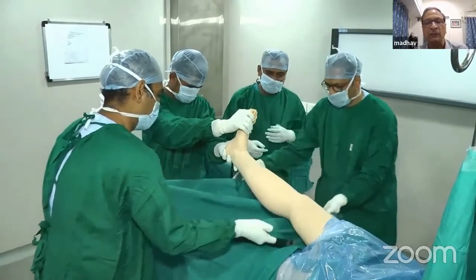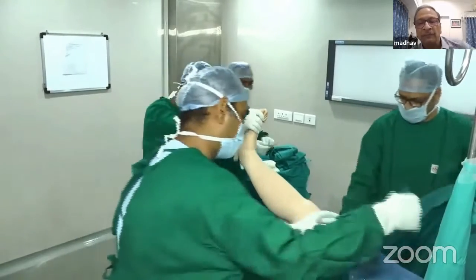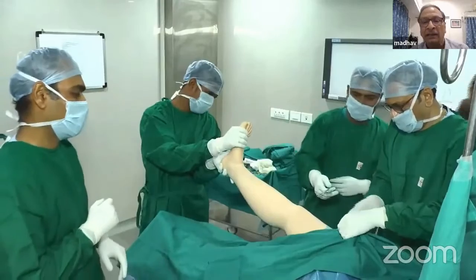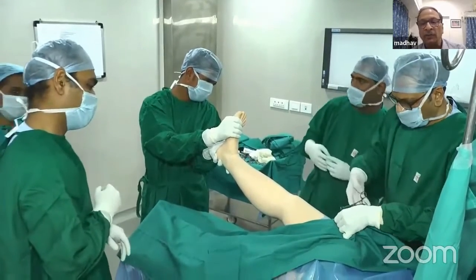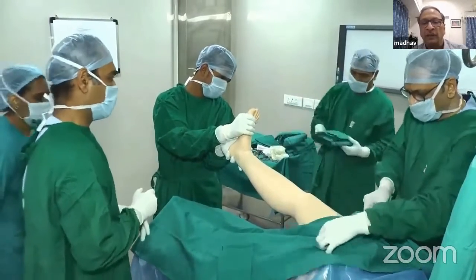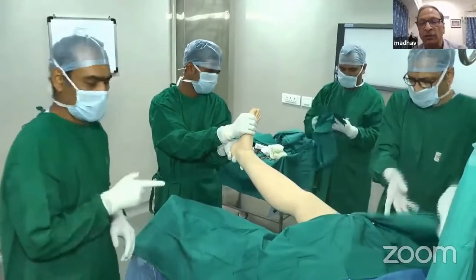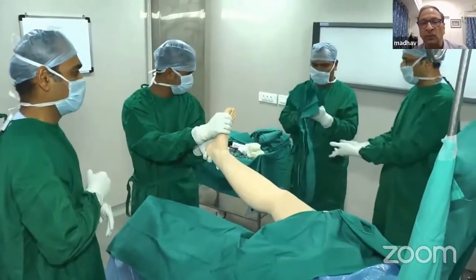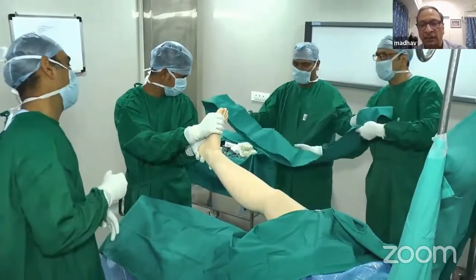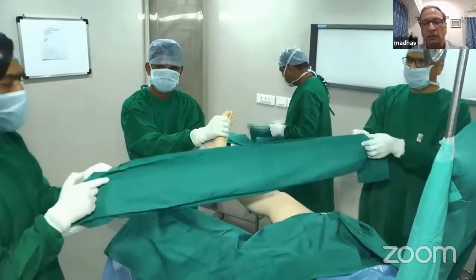Next, take another big sheet and open it from both sides, take it around the thigh, bring both ends anteriorly, and secure it just below the tourniquet with a towel clip. Take special precaution that you don't puncture or pinch the tourniquet, because if you are using a sharp towel clip, there is a danger of puncturing the tourniquet. Be careful where you apply the towel clip.